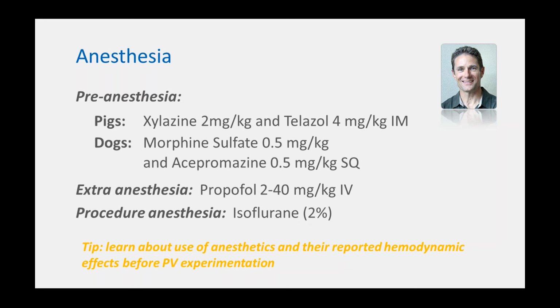Even though isoflurane's a vasodilator, it has some pulmonary effects, and it definitely depresses cardiac function to some extent. But for the most part, we're always comparing one group to the next, and we try to maintain everything similar from group to group, and so even though there might be some depressive effects with isoflurane, the advantages way outweigh those effects, and so we can move on using isoflurane.